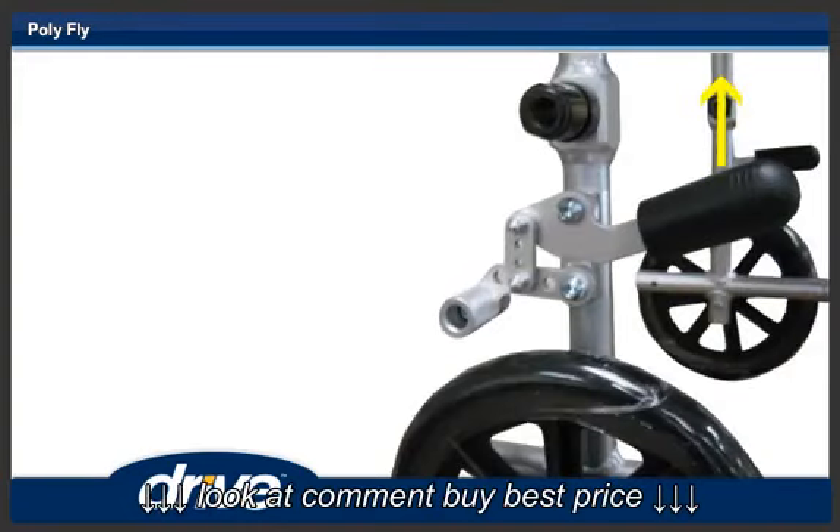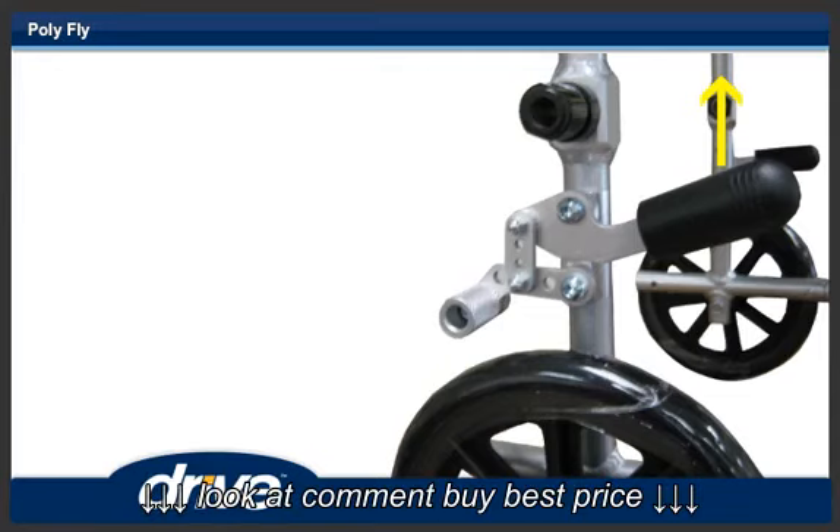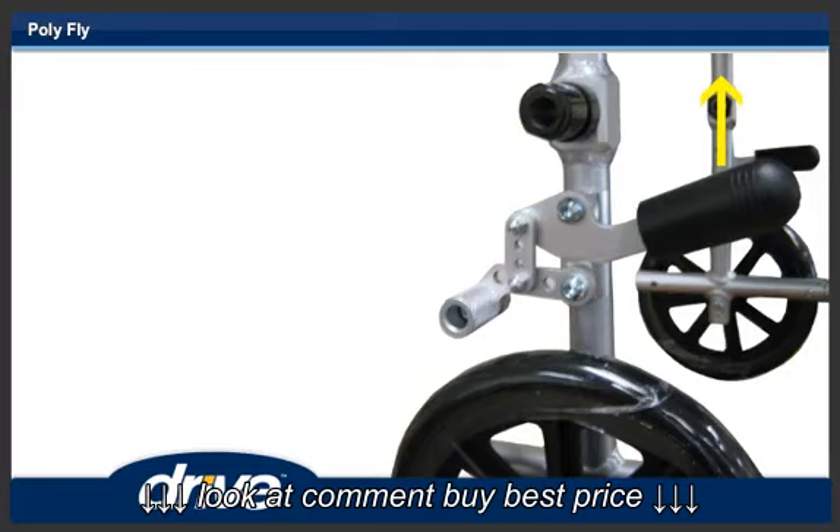Step 13. To apply the wheel locks when the Polyfly is being used as a transport chair, pull up on the wheel lock to engage the wheel lock. When using the Polyfly as a transport chair, the wheel locks must be engaged by the attendant, not by the person in the chair.